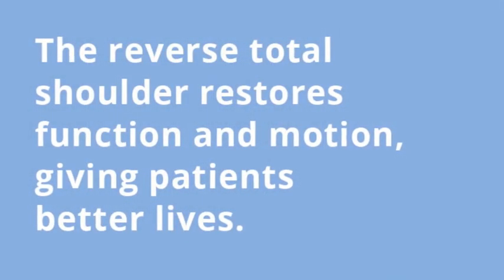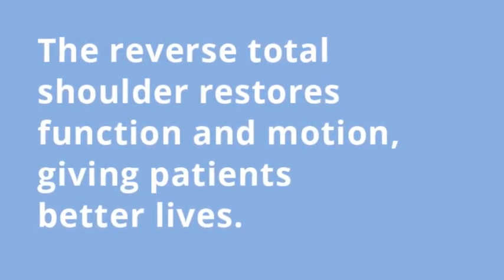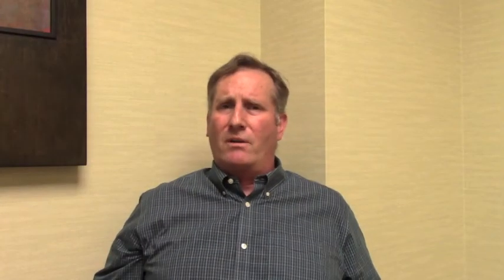We've recently started using advanced scanning techniques like MRI and CT to generate custom blocks that help us do the surgery more accurately and more proficiently. The reverse total shoulder is so much more proficient at restoring function and motion than the total shoulders we did in the past. It's really given us a new tool to restore the anatomy and function in a way that gives patients quality of life. It is a very satisfying procedure, and to see those patients in the office year after year is very enjoyable for me.